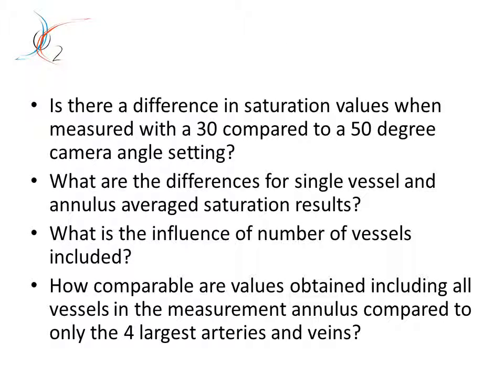Now, I've looked at that because a lot of people are using a 50-degree image, other people a 30-degree image, and when you analyze your results and write them up and want to compare, how can you compare them? Is it good to compare them? How much variation is in there?